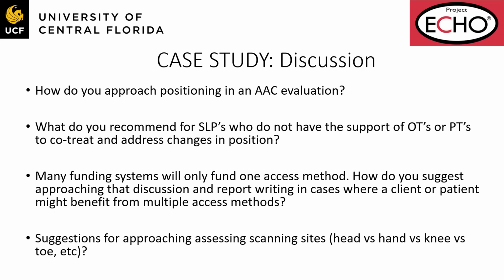Do you like to be in that position, or is there a reason you need to stay back, or can you come up more? Sometimes individuals themselves can give you a lot of feedback about what works for them and what doesn't.